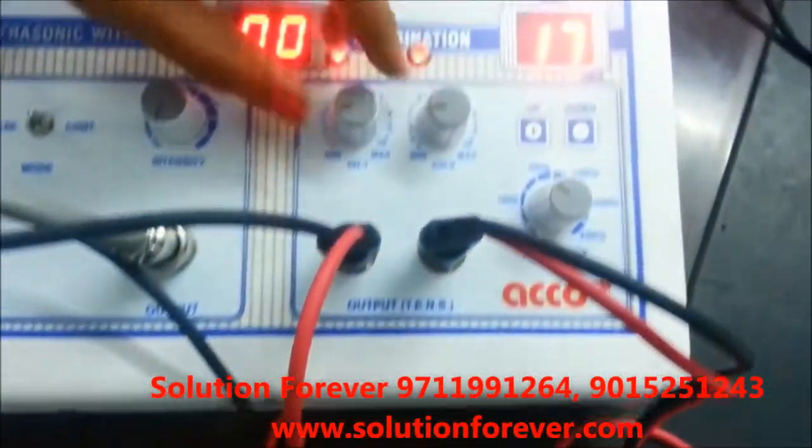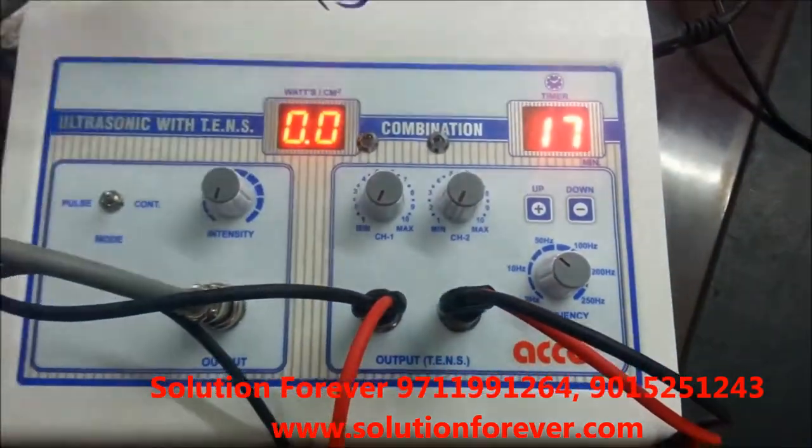After treatment is completed, make all the intensity knob at zero. Switch off the machine.